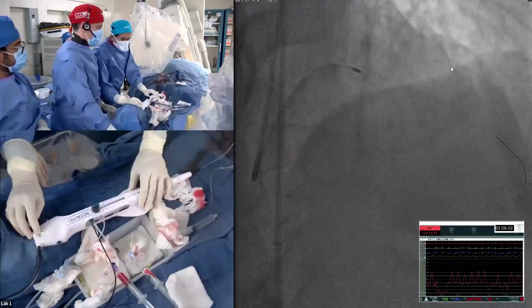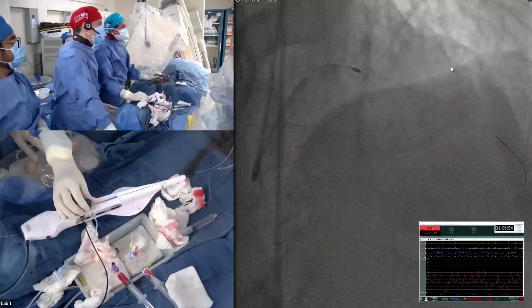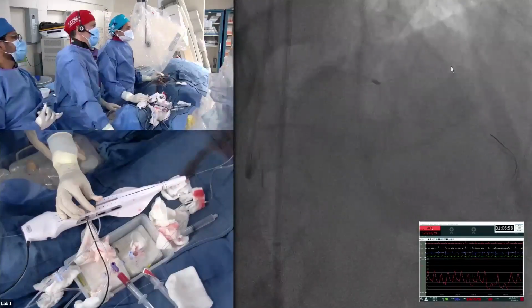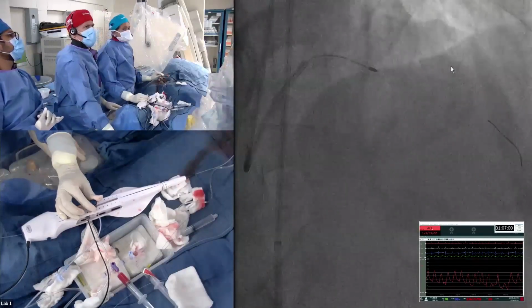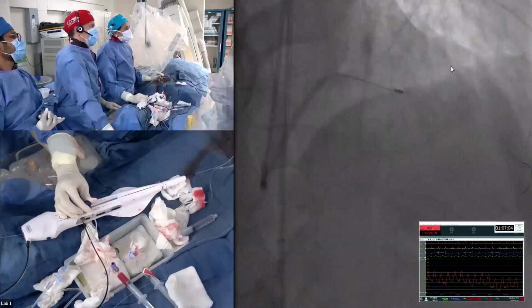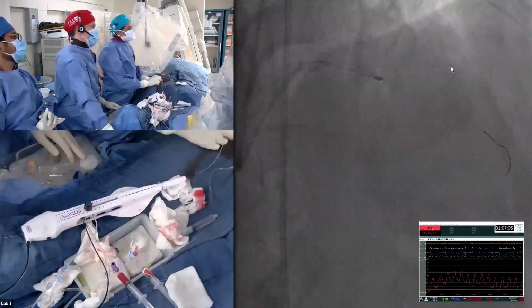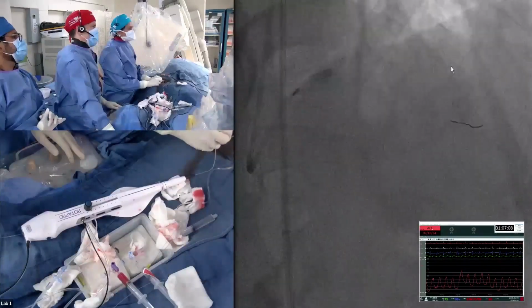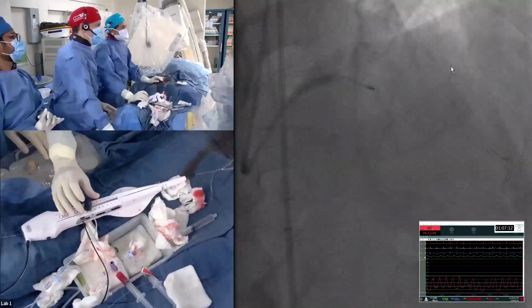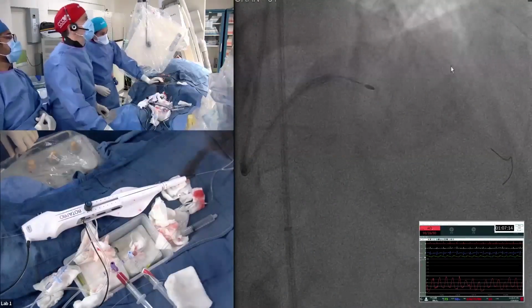Ready? Now, this is also not an easy rota. You look at that. How many RPMs? Slow. How many RPMs, Dr. Keeney? It's very tight. About 150. 150, okay. So low speed. You see the angulation of the burr. You see that? It was getting stuck. Guide is getting set. You saw that? It was stuck at the ostium?